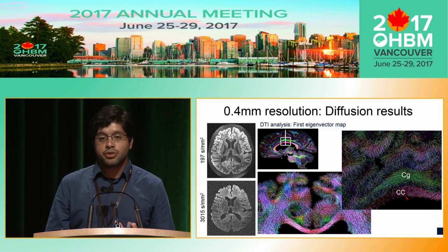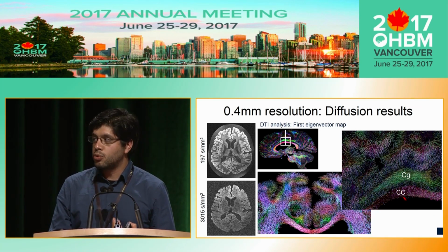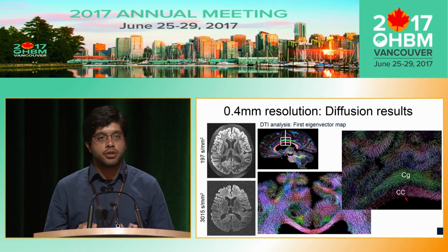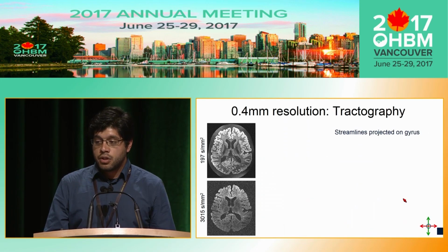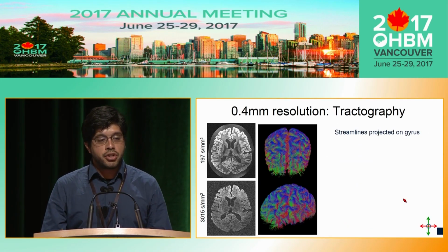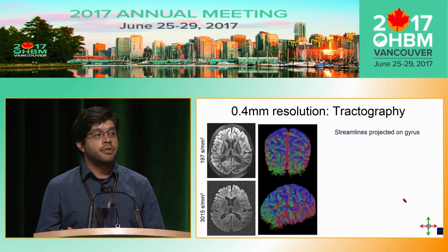And we see that for this resolution, we can start to get advantage to do more analysis and to study it better, because we can have a better definition of these structures. So now I can take this information, I can take these results, I can do tractography.